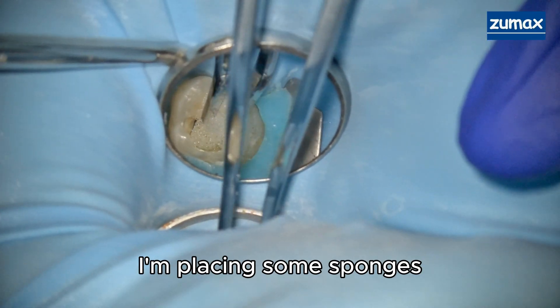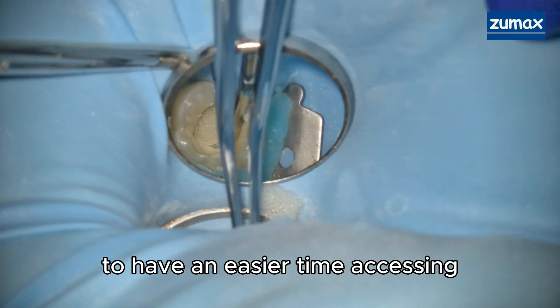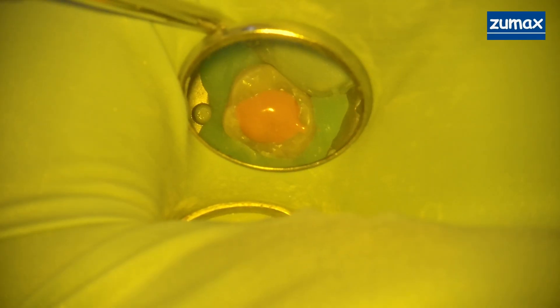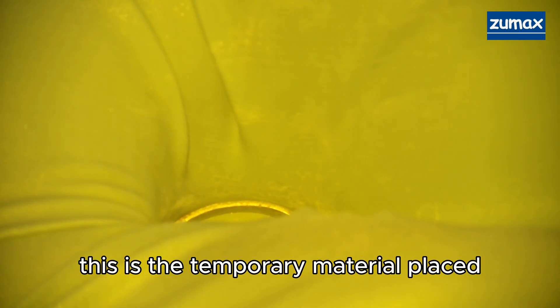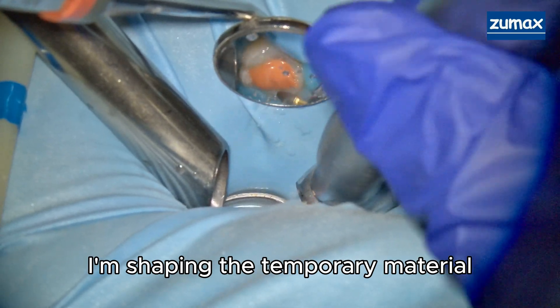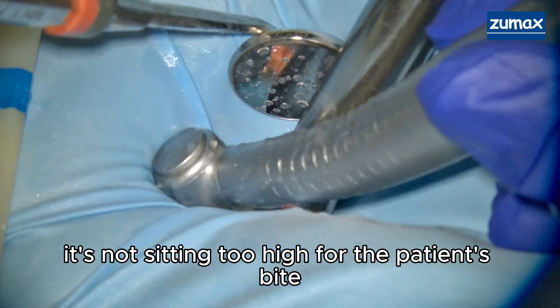I'm placing some sponges so that I can place a temporary material on top to have an easier time accessing at the second appointment. This is the temporary material placed — it's a GI — and now I'm shaping the temporary material so that it's not sitting too high for the patient's bite.